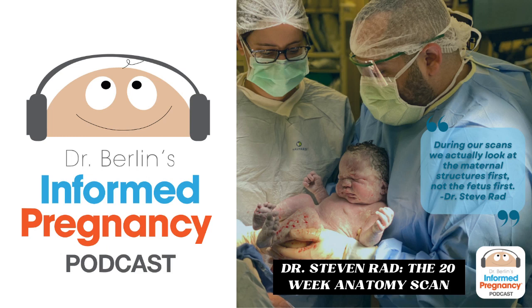And it will put the image together. For example, if you're looking at the fetal face, it'll render it into a 3-dimensional image of the fetal face. If you break down the image, you can actually look at the structure in the various different planes. So if you're doing a 3-dimensional view of the heart or the kidneys, you're not going to get that face picture, but you're going to get 3 different planes of the kidneys.